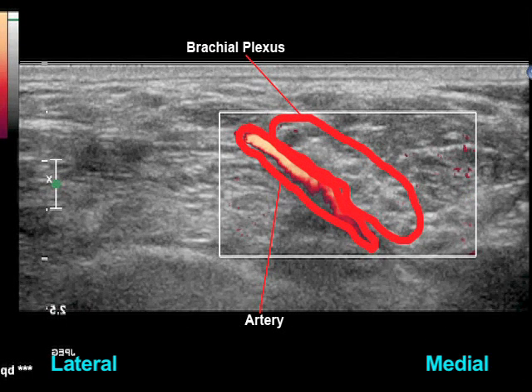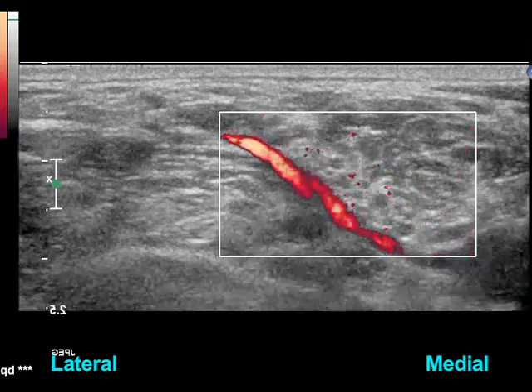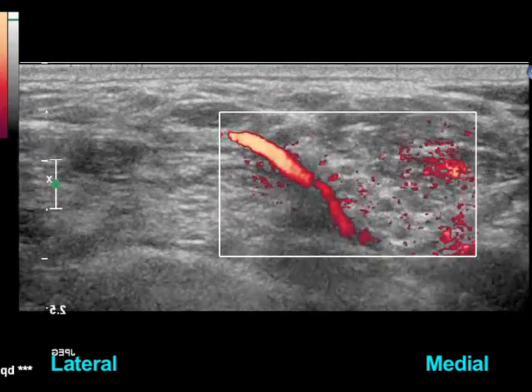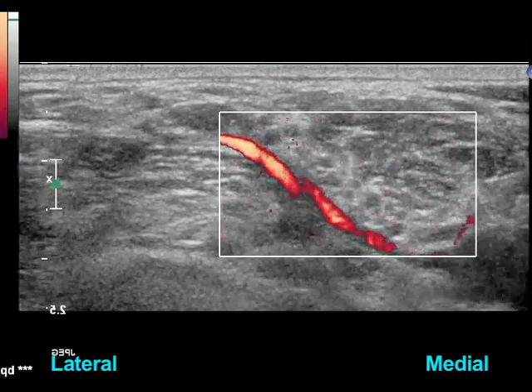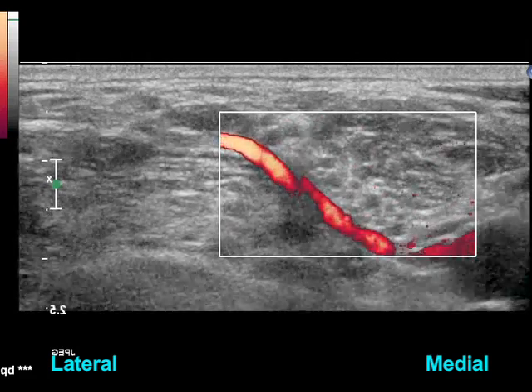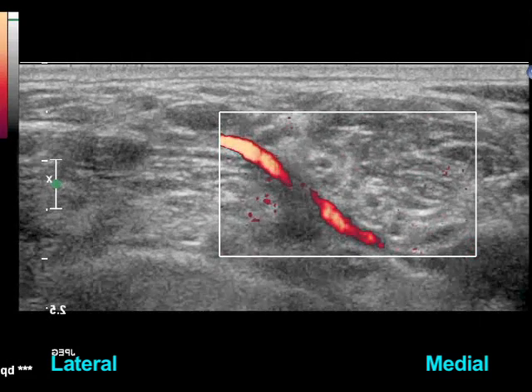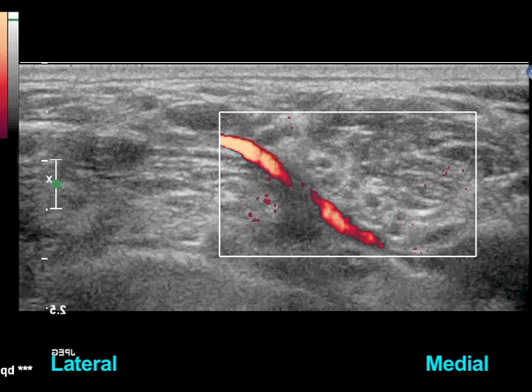There are several important landmarks when performing brachial plexus blocks above the clavicle. The posterior triangle of the neck is highly vascular and often contains blood vessels adjacent to the brachial plexus. Visible pulsations or Doppler imaging can help identify these vessels.